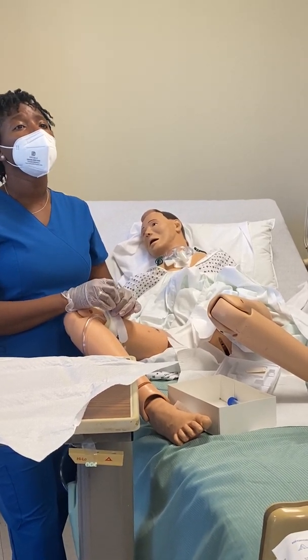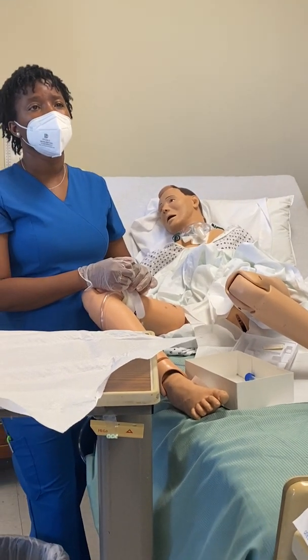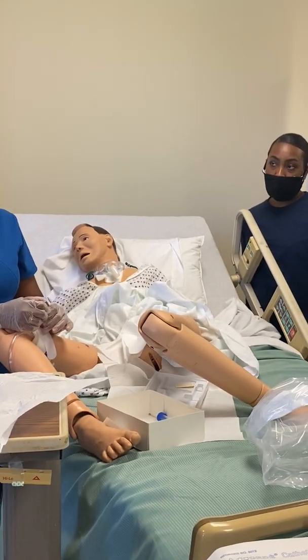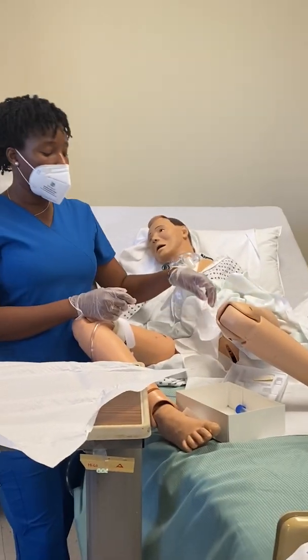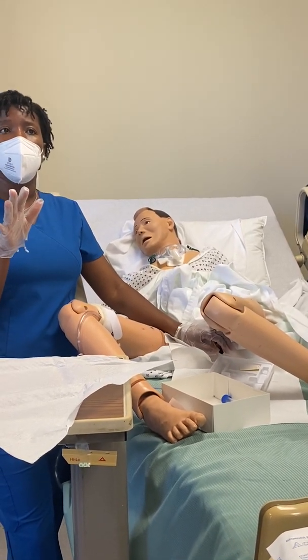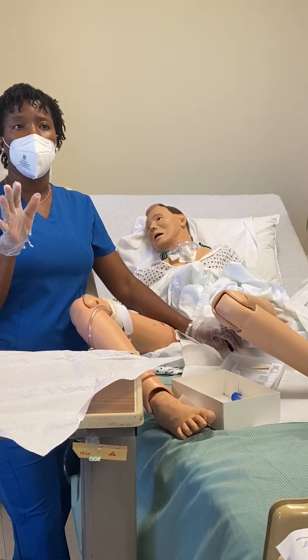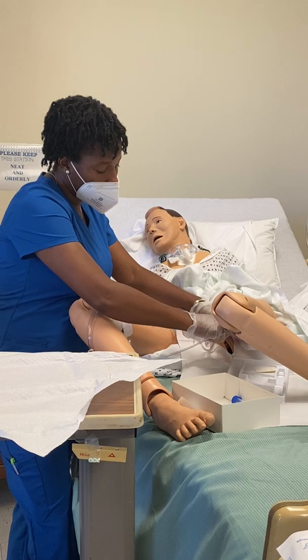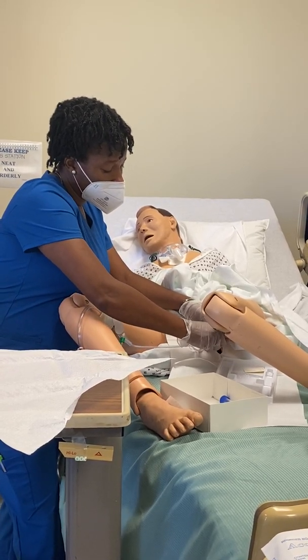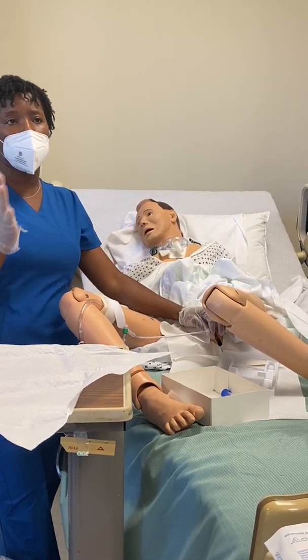So when you put the strap around the leg, that's not considered sterile, is it? Once you get it in, Jordan, and you put that bulb in, you're done. The sterile portion is over. Once you get that catheter in and inflate that bulb, the sterile portion is over. Remember how I put it in and I said, okay, I see urine, so I'm gonna insert 1 to 2 more inches, and I did this, your sterile part is over.